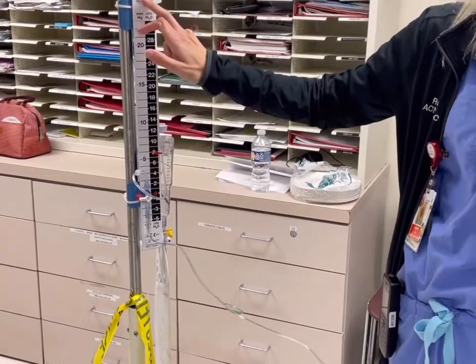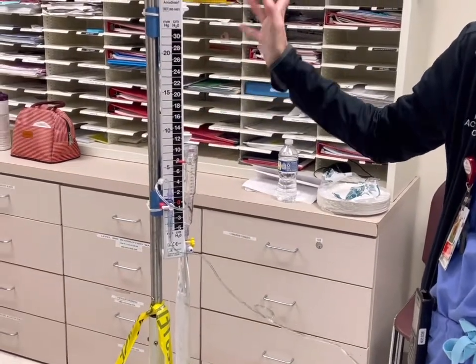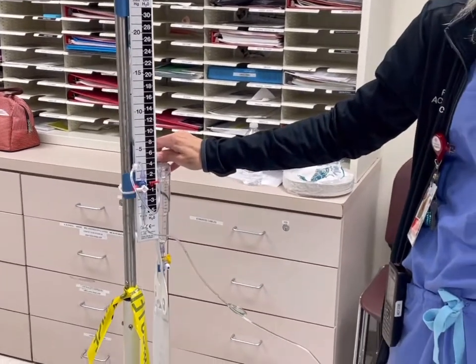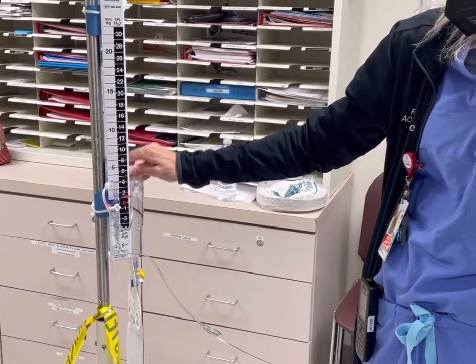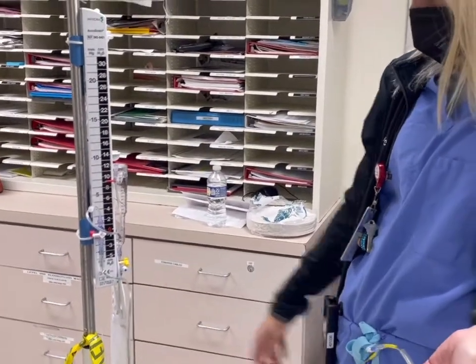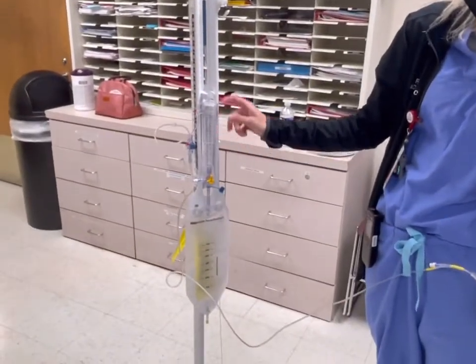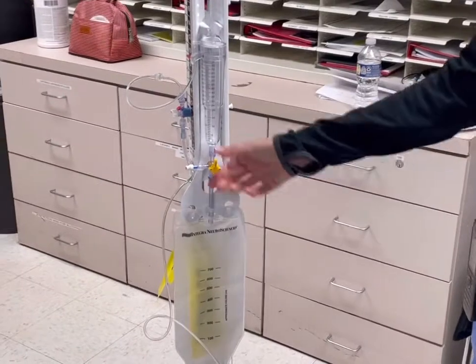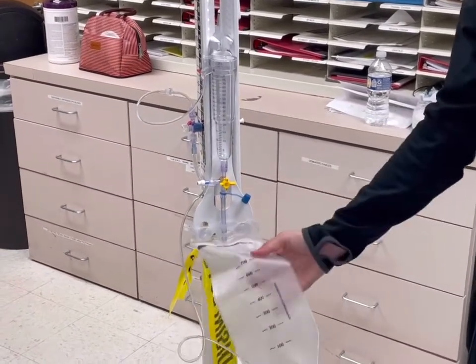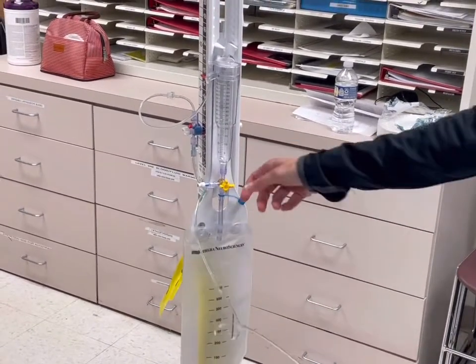mercury. There is one new neurosurgeon that likes to use mercury for some reason. I think that's just how she was taught. But usually you level it to whatever the doctor orders, usually 0, 5, or 10. And then you have the drainage system, which collects in this little canister where you measure the CSF, and then you turn the little knob so that you can flush it into the drainage system, on and off, one-way valve kind of thing.